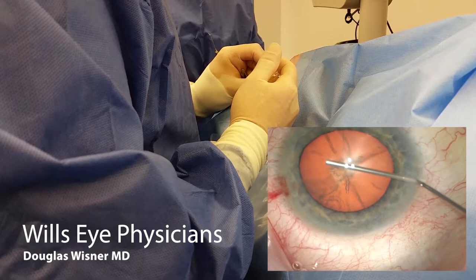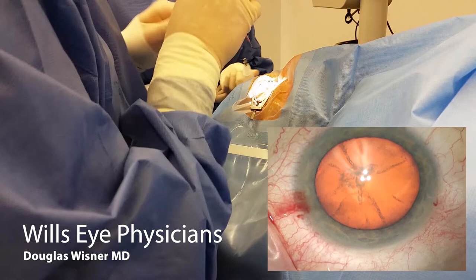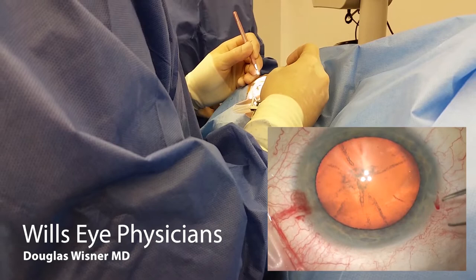Here I'm using a dispersive viscoelastic to fill the chamber. You can see I go in, inject a little, start distally, and then let the wave of viscoelastic push fluid or any air bubbles out. Once you see a little burp of viscoelastic out of the paracentesis, you know you've got enough in the eye.